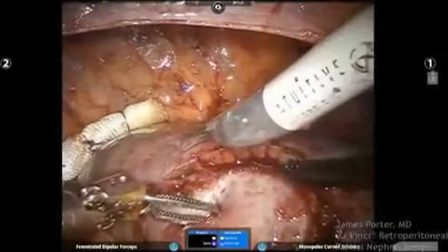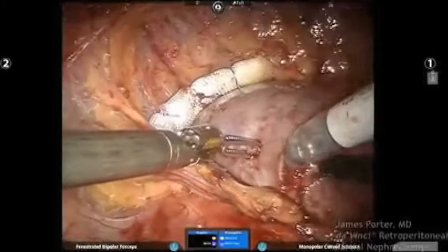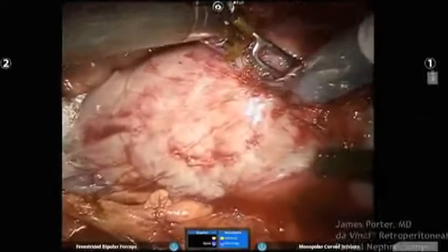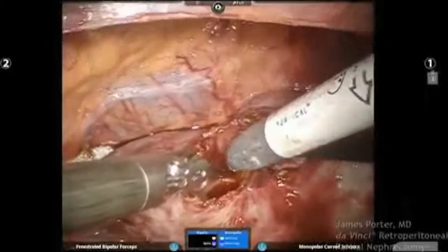Now you can see how Dr. Porter's doing a nice resection, how he's aiming his scissors down, because the ultrasound localization demonstrated the depth of penetration, so he needs to go down deep enough before coming across the base. He's doing a very nice job, and you can also see that the assistant occasionally is sucking in the crevice and the runoff in order to help keep exposure maximized.